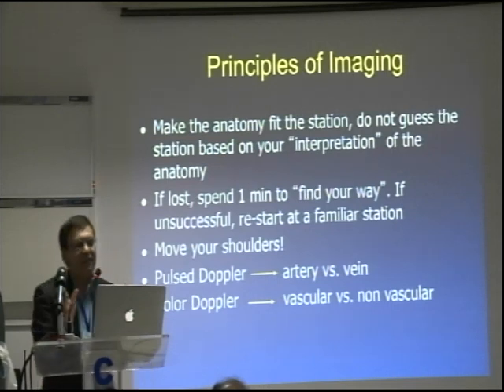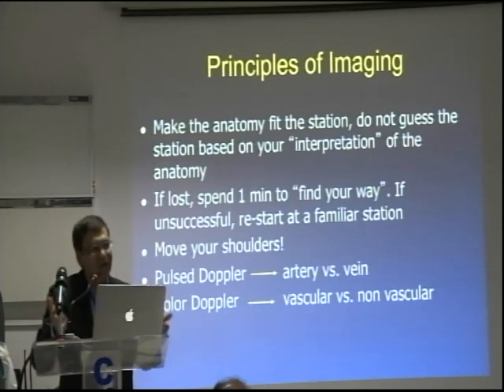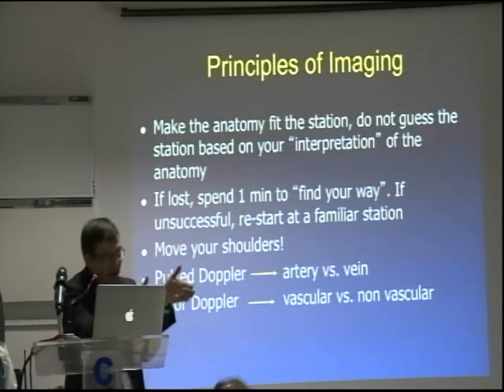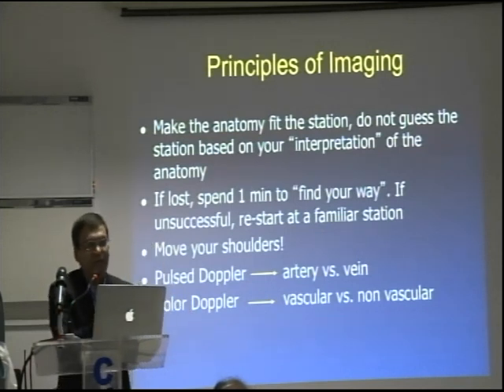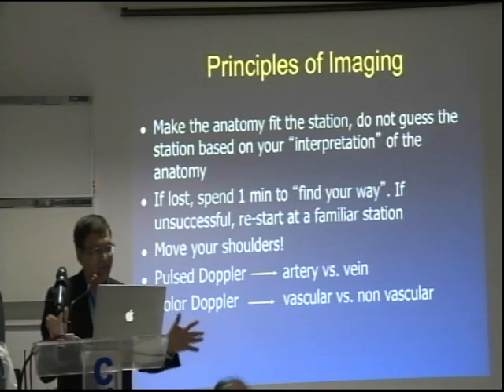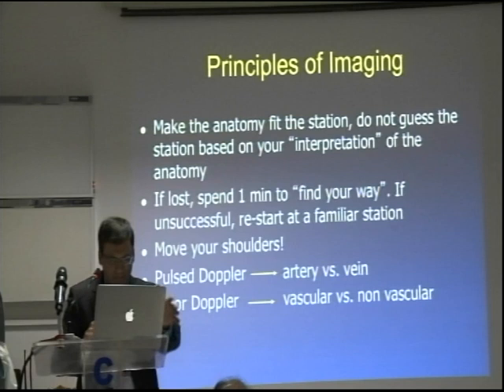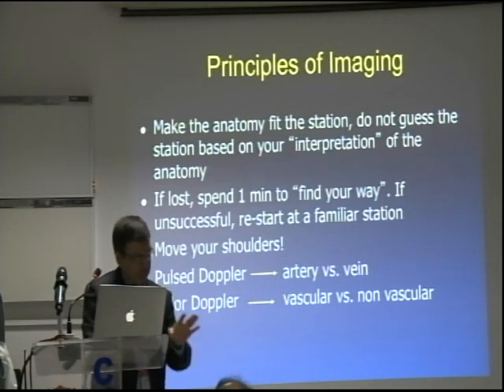Here, if you think this is a structure you may have made up in your head, don't make up stuff in your head and say that you are right, the body is wrong, which is right in front of you, or God is wrong, okay? So make the anatomy fit the station, don't guess, okay? And if you are lost, you are going to be lost for many years again and again, okay? Spend some time, try to see if you can get your way around that.